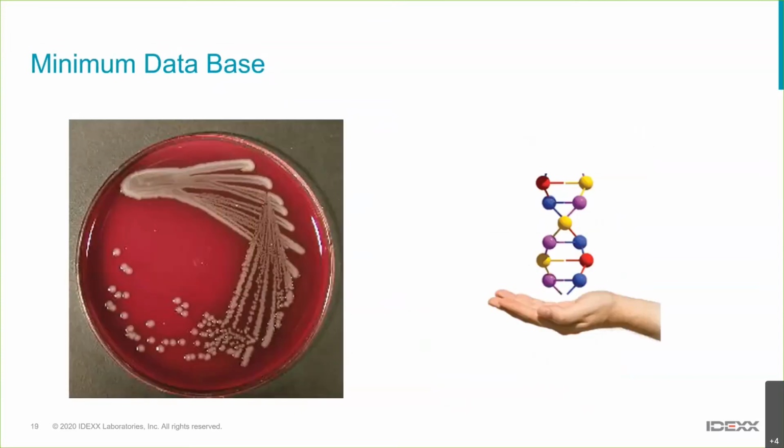There are some patients based on their clinical history that we may want to do microbiology on. A patient with signs of urinary tract disease, or a patient with significant ear disease, or an abdominal effusion where we're worried it's inflammatory. If we've got urinary tract infections based on our clinical signs and sediment exam and things like that, doing a urine culture is important.